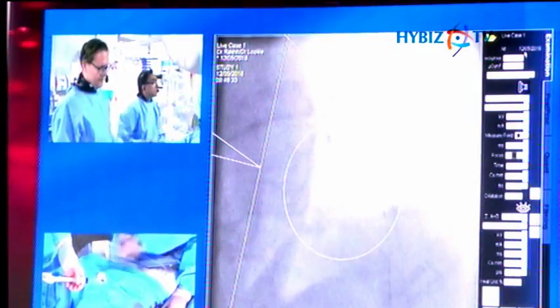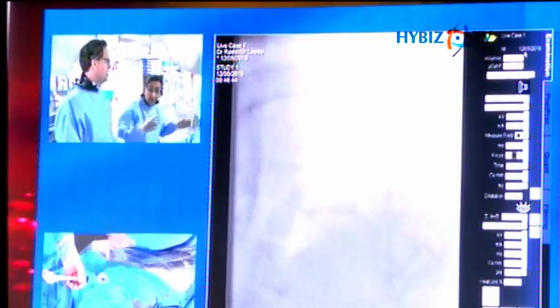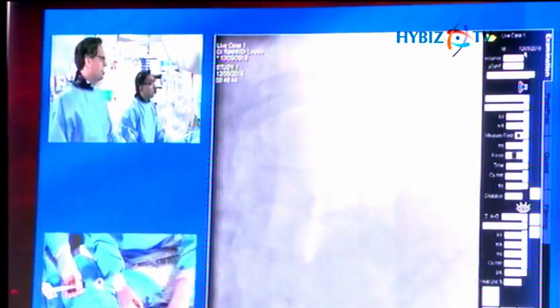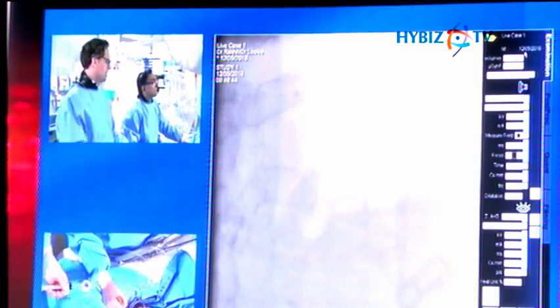The patient's having a little bit of chest pain, so we're going to come down. And then the key here is go onto normal mag. The sheath is now trapped behind the stent, so you need to be very cautious. You back your guide out a little bit. We're purposely using a non-aggressive guide here, a Judkins guide, so Robbie can hopefully back the guide out. As you pull, it's a bit like pulling out a jailed side branch wire. You just need to gently pull back, so they come down slowly.